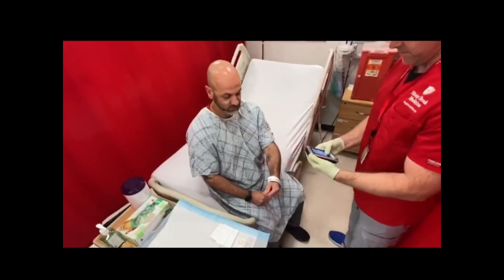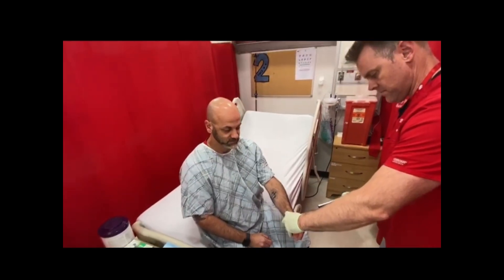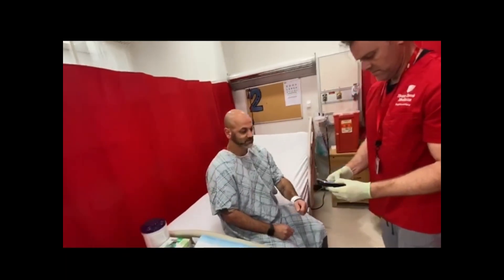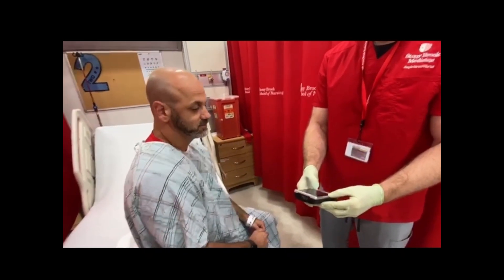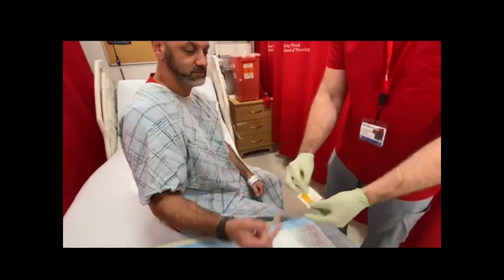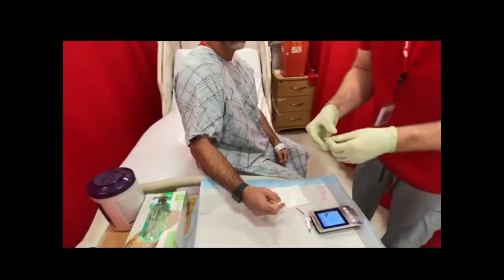Scan the patient and confirm patient ID with two identifiers. Choose patient type and sample source.